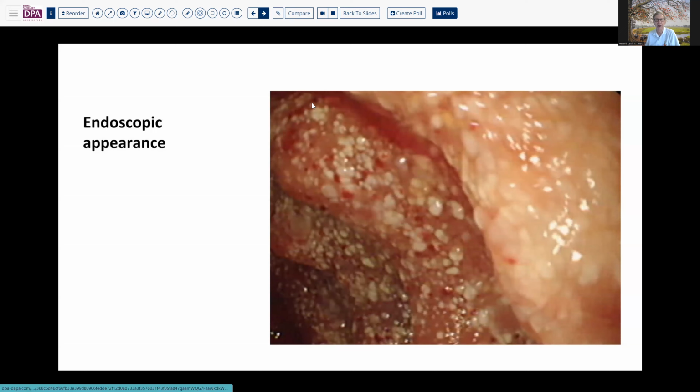Thanks for joining me today as we consider some additional digital slides and the appropriate sign out for these cases. Our topic today comes from the realm of GI pathology.